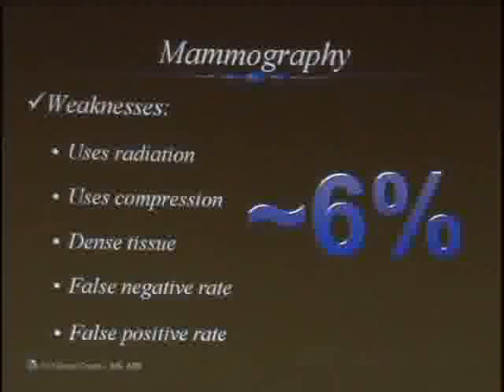And if it's a very high density breast, you'll hear us say the caveat of, in the setting of high density breast, 20% miss rate. We want you to be really clear on the fact that this test is compromised by the density of the breast material. Now, false positive rate is much lower. We're very good at making sure that we're not wrong about what we're seeing.